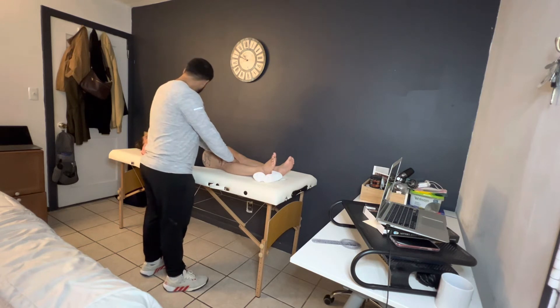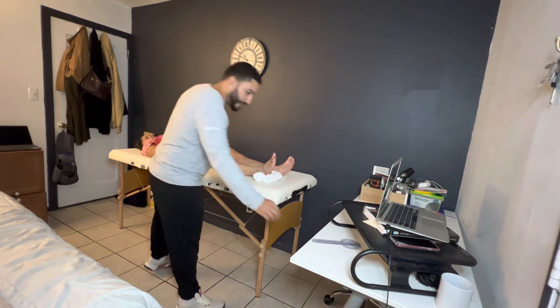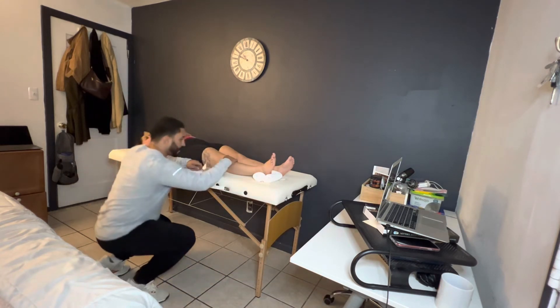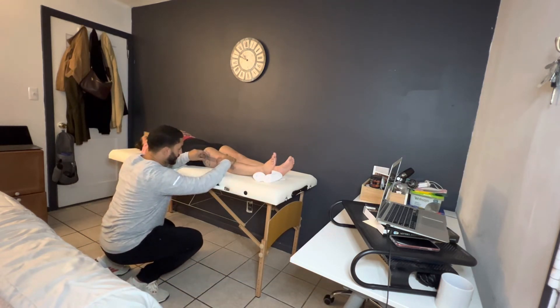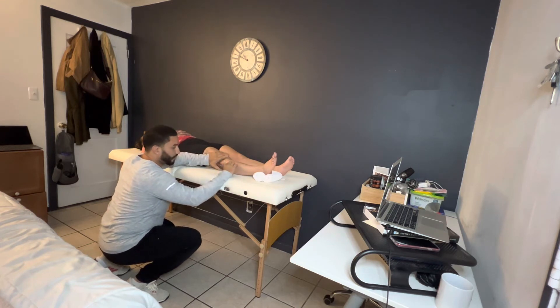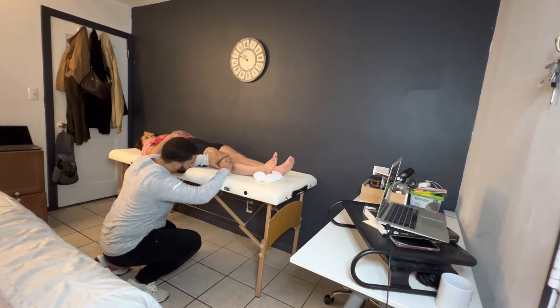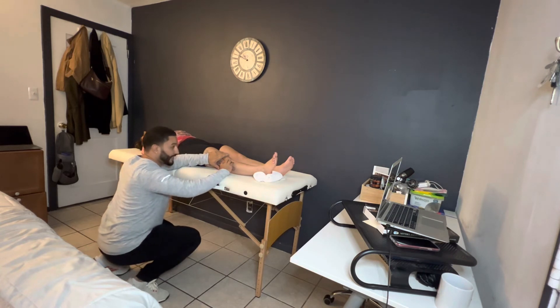Any discomfort at all? All right, perfect — relax right there. I'm going to grab my goniometer one more time. I'm going to find the same points of location on the leg, pointing my free portion to the lateral malleoli of the ankle. It looks like we have just about five degrees of range of motion in our knee.